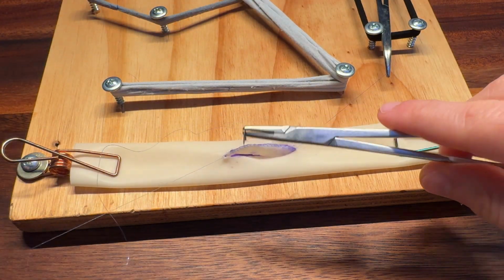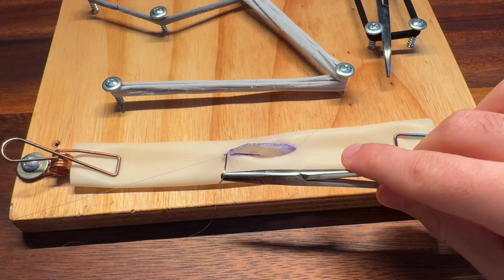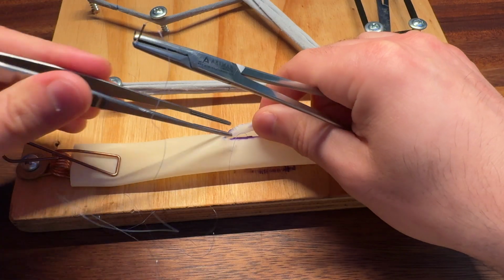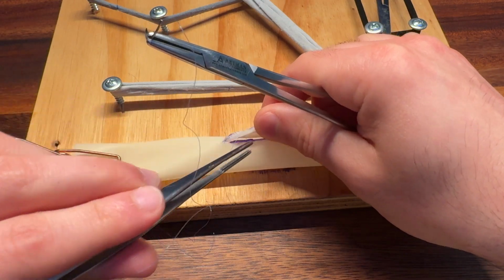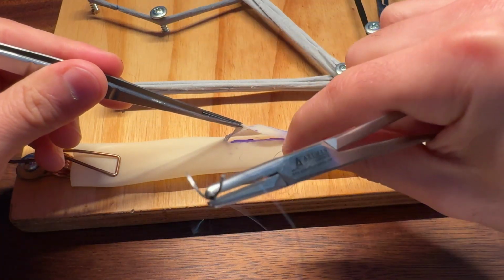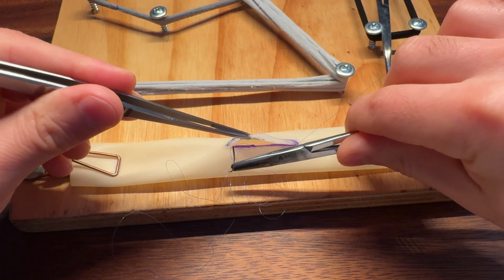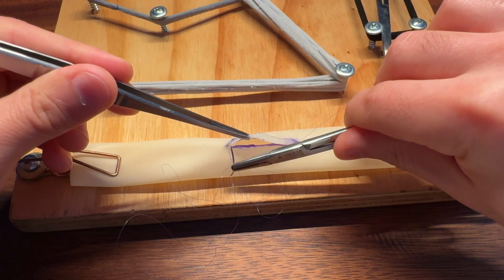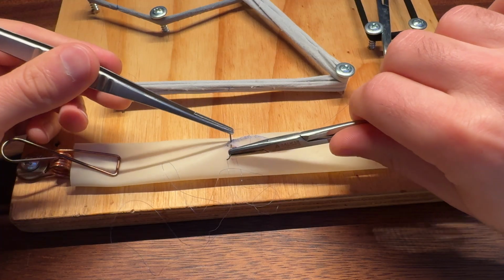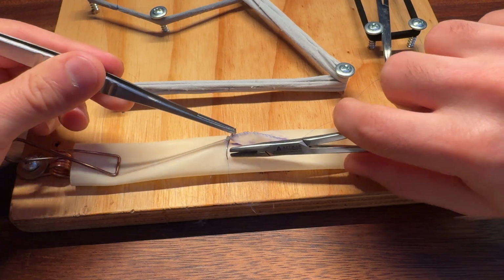Okay, so I'm on the inside of the blood vessel, so I need to come out. So again, backhanded throw, and I'm going to aim for something very close to the edge here, across from where I made that throw on the inside there. So maybe somewhere around there, right there. That should be good.